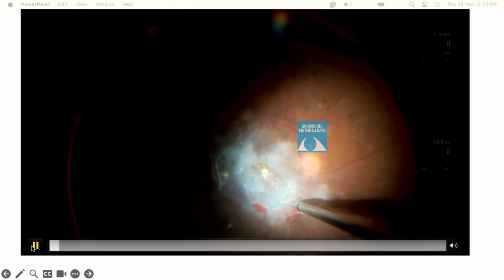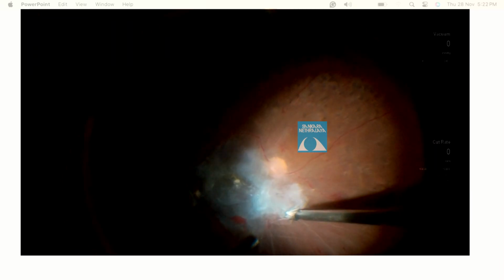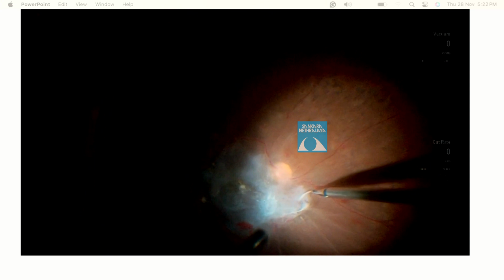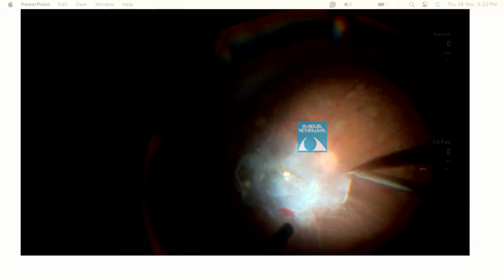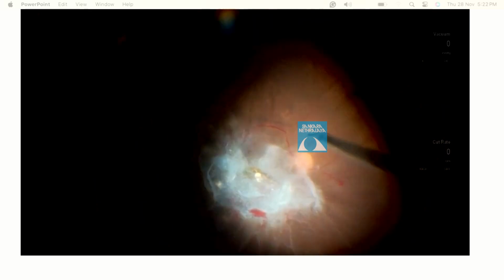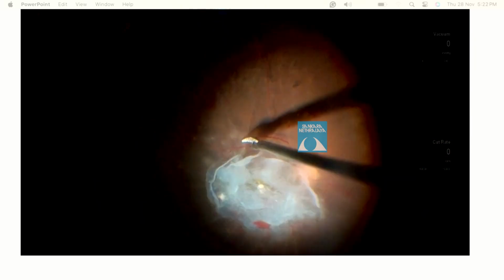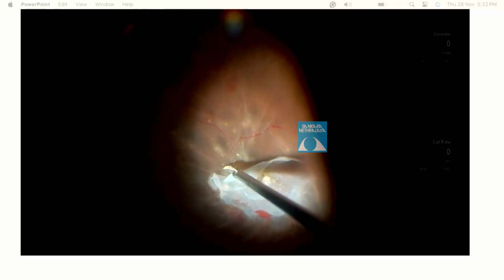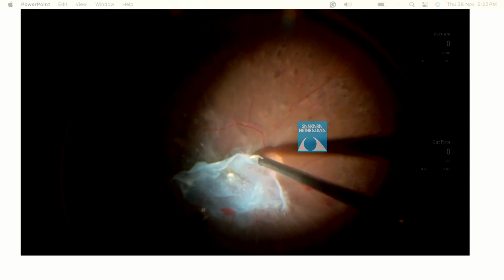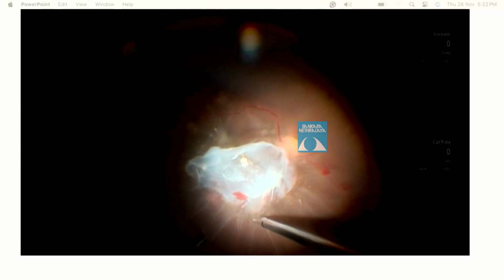This video shows a unimanual technique of dissection using a curved scissor. This shows the scissor is parallel to the retina as compared to segmentation, where the scissor will be perpendicular to the retina. So we go in between the retina and the membrane. We lift the membrane and identify where the epicenter is, and we gently remove it with the scissors. Using both blunt and sharp dissection, the epiretinal tissue is removed from the underlying retina, and then the cutter can be used to remove the membrane.